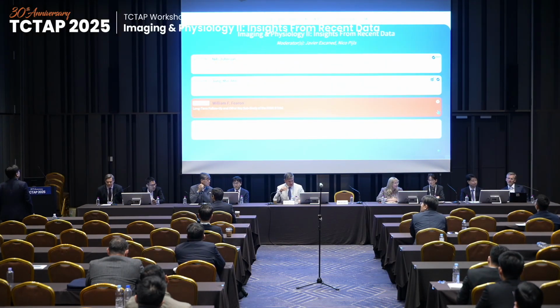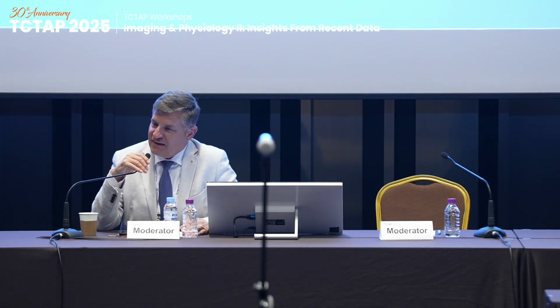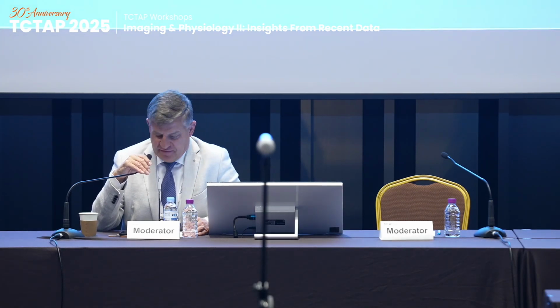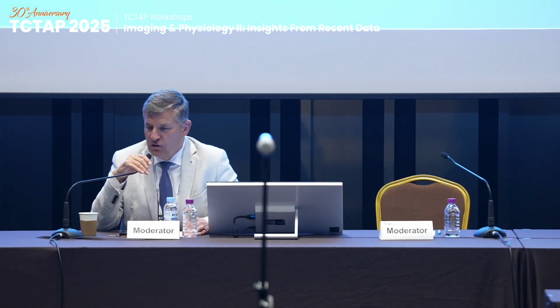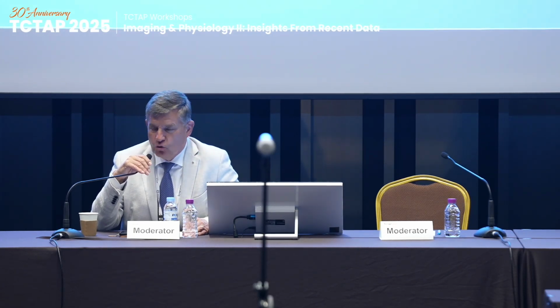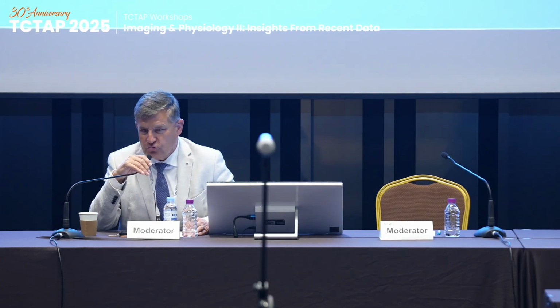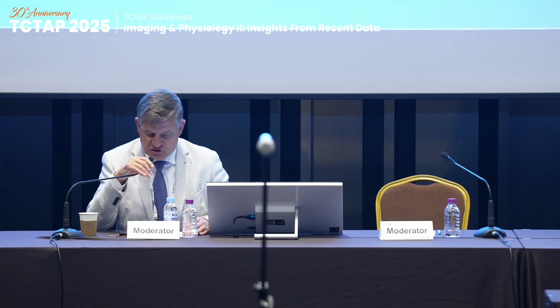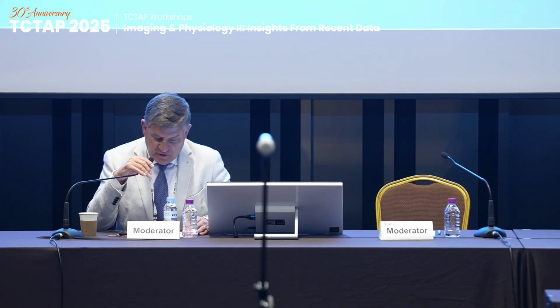Thank you, Dr. Johnson. It is very interesting, and it is clear that pressure measurement is very simple to perform. However, you should be aware of this kind of pitfalls. And the big common message, in fact, is that you should never only look at the numbers on the screen, but look at the tracings. Then you will notice what is wrong, and you will notice if your observations are indeed reliable or artificial. We will continue with the next presentation.